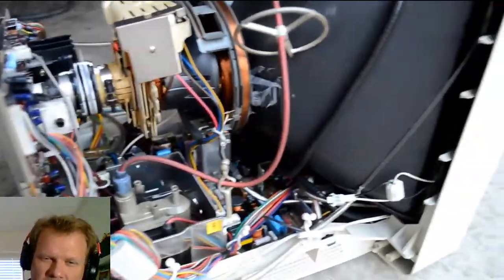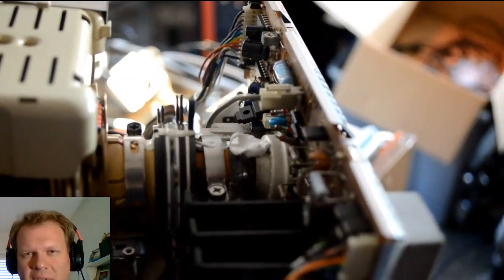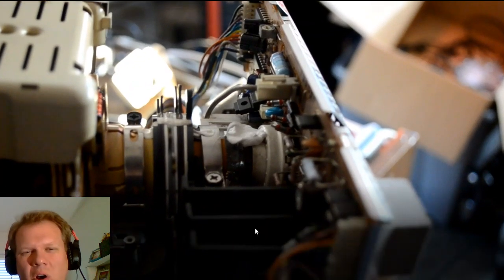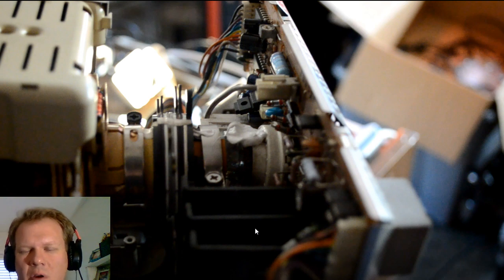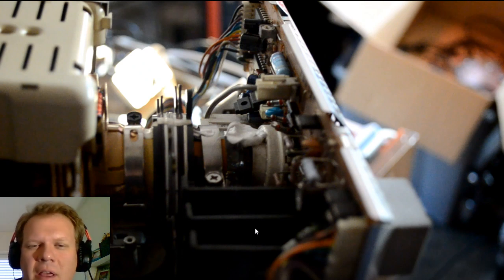So the ones that I had, I cleaned it thoroughly, but there was a lot of dust built up in it. And I inspected everything because the capacitors are from the year 2001, and it's not too long for them to still be in good shape for a while. So if nothing's wrong with the screen, which nothing was, we just kept the same capacitors in there for now as requested by the client.